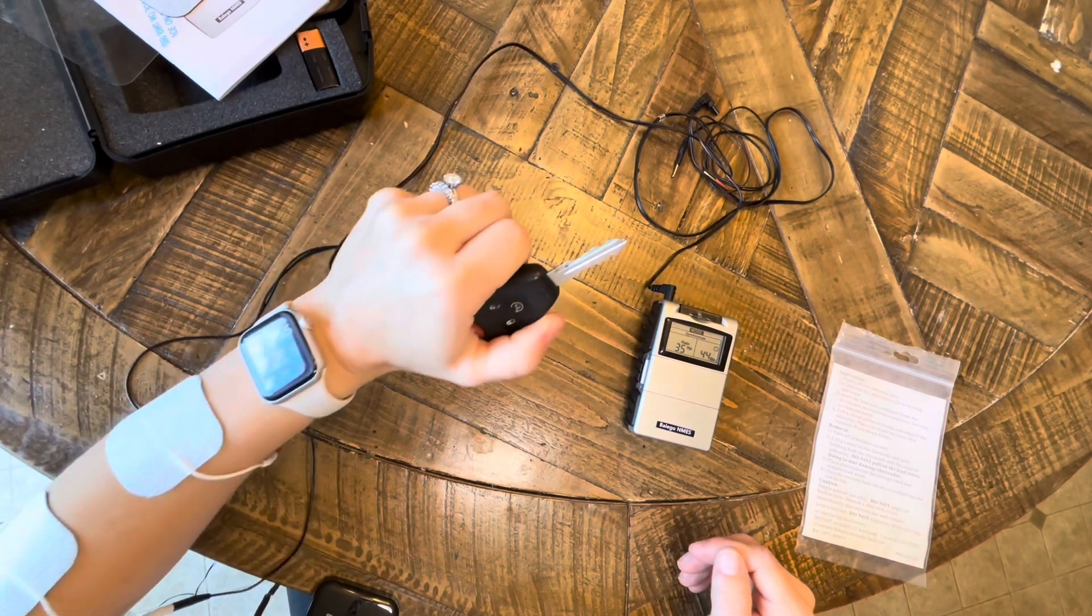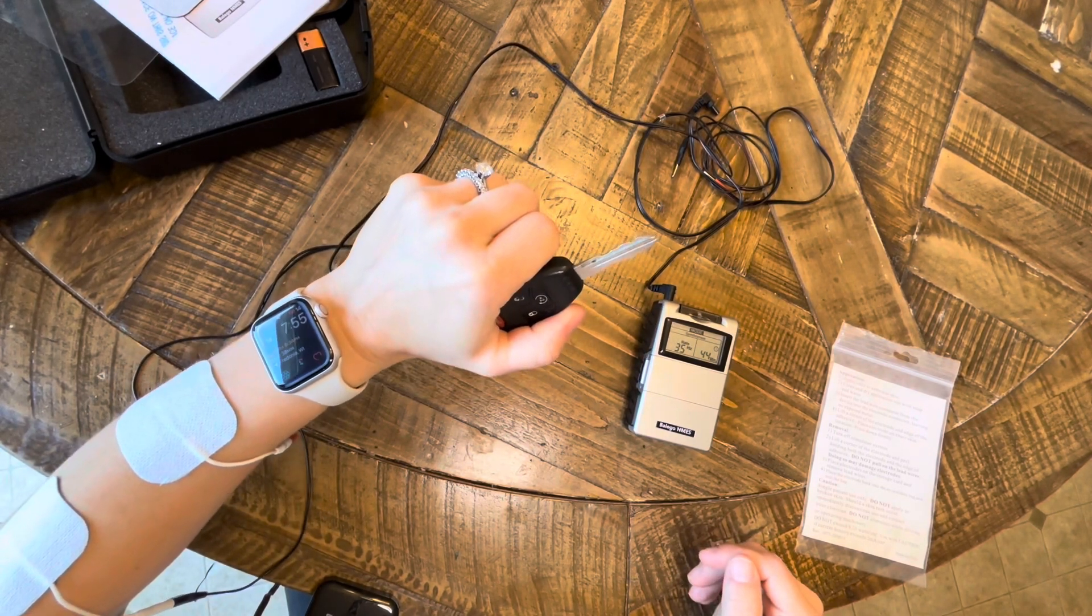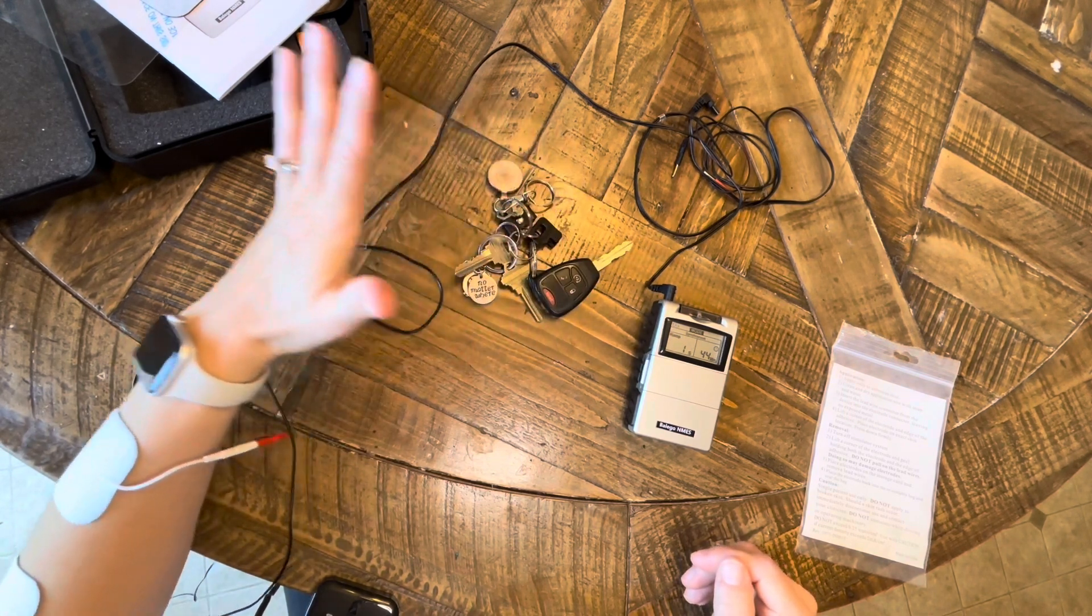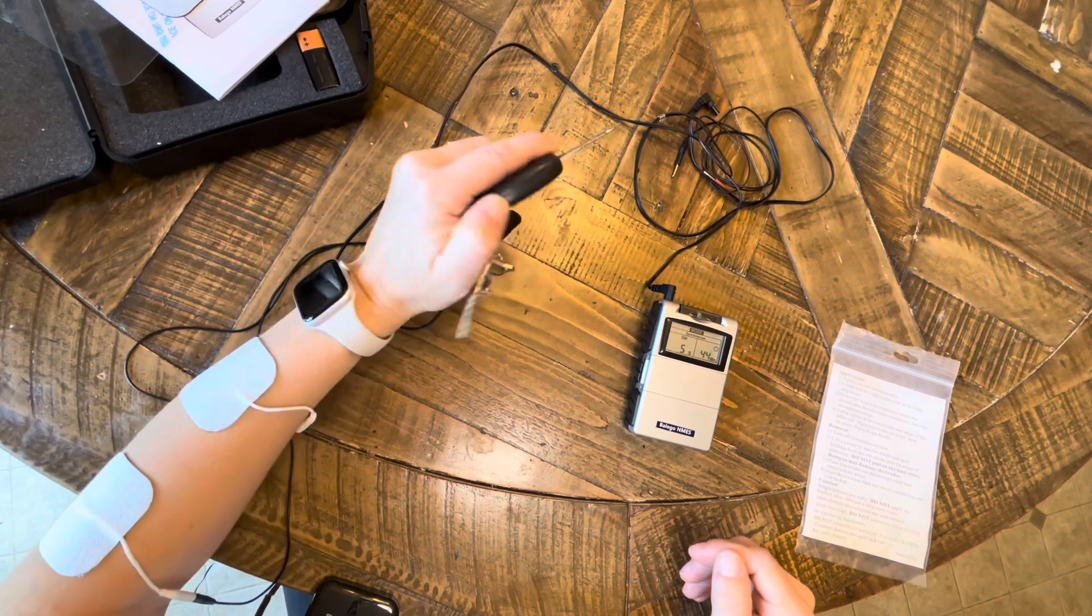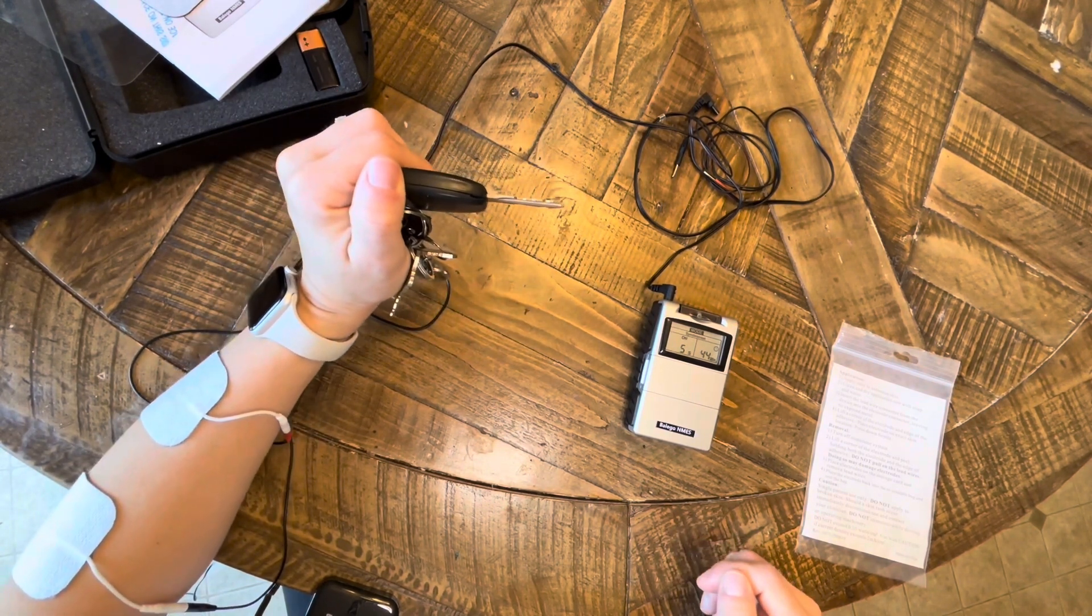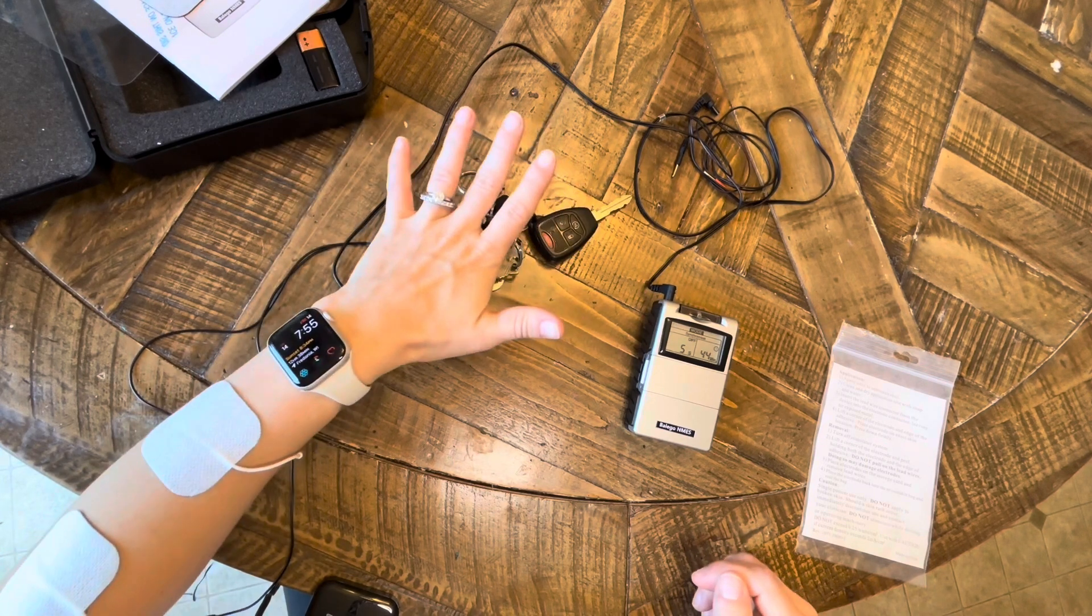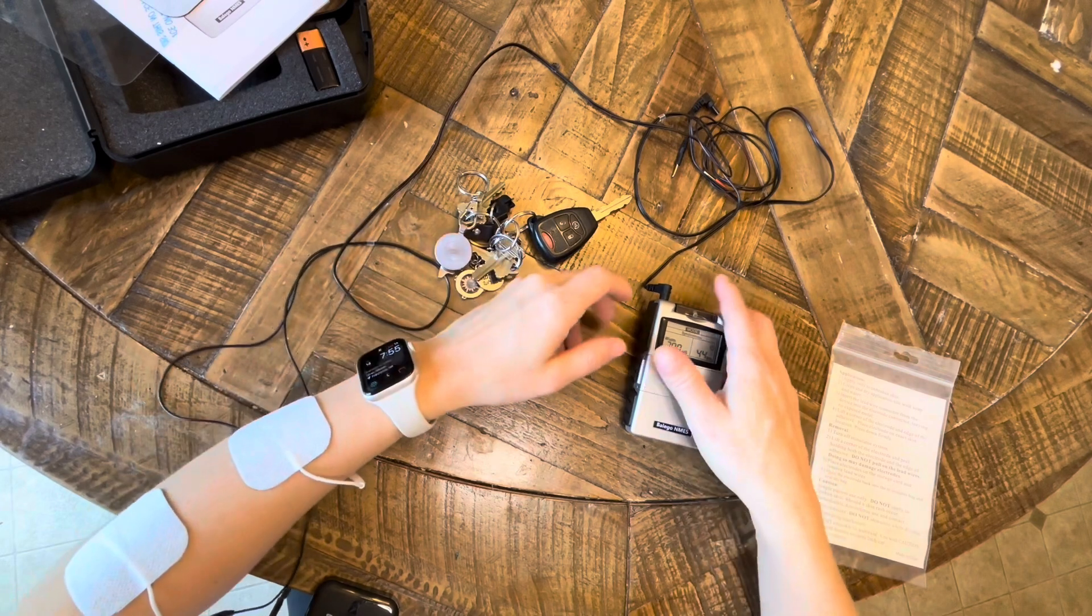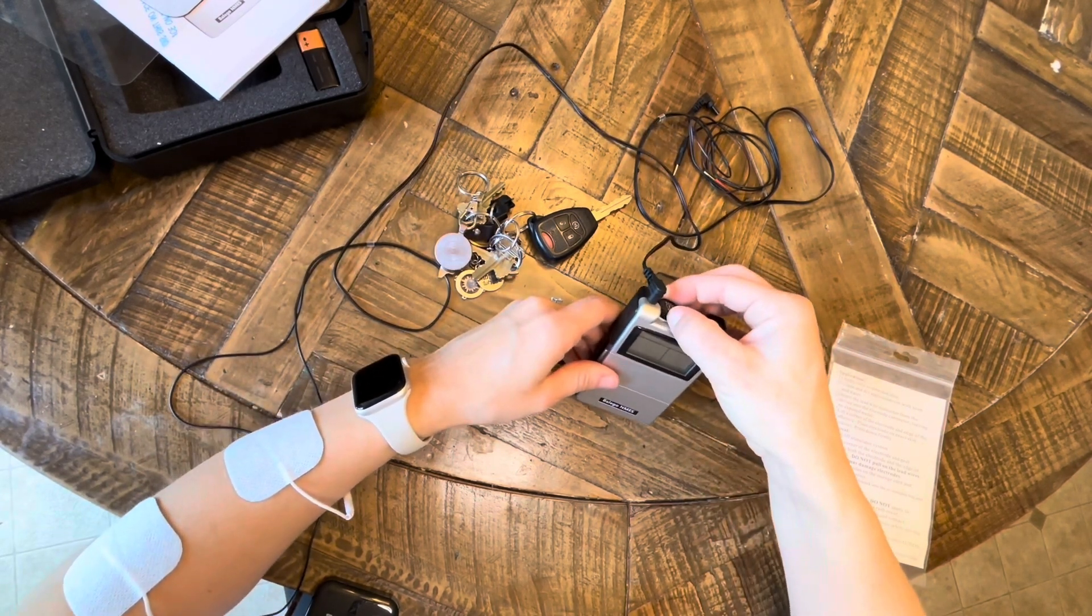The whole point of e-stim from a stroke rehab standpoint is to improve motor recovery. So if you combine functional e-stim with an actual task—say grasp and release functional items—that will promote more neuroplasticity, that will promote more reorganization of the brain and neural connections.